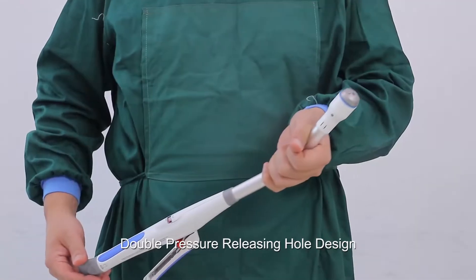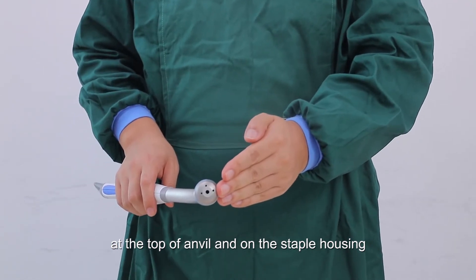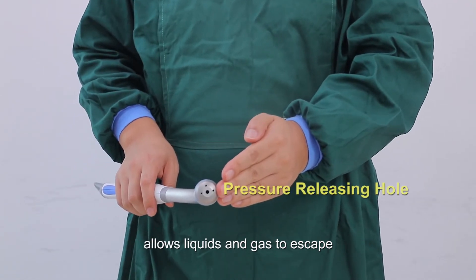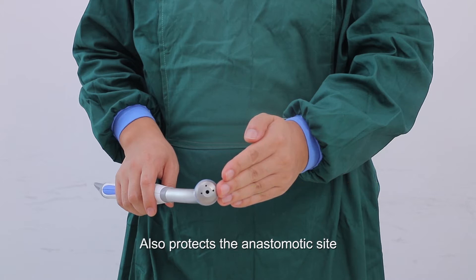A double pressure releasing hole design — one at the top of the anvil and one on the staple housing — allows liquids and gas to escape, thereby minimizing pressure inside the digestive tract, protecting the anastomotic site, and lowering the potential for tissue trauma.